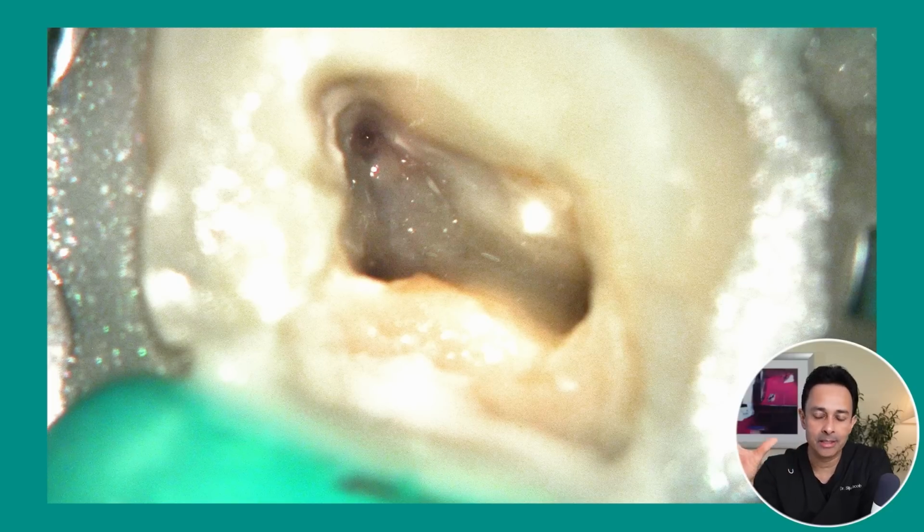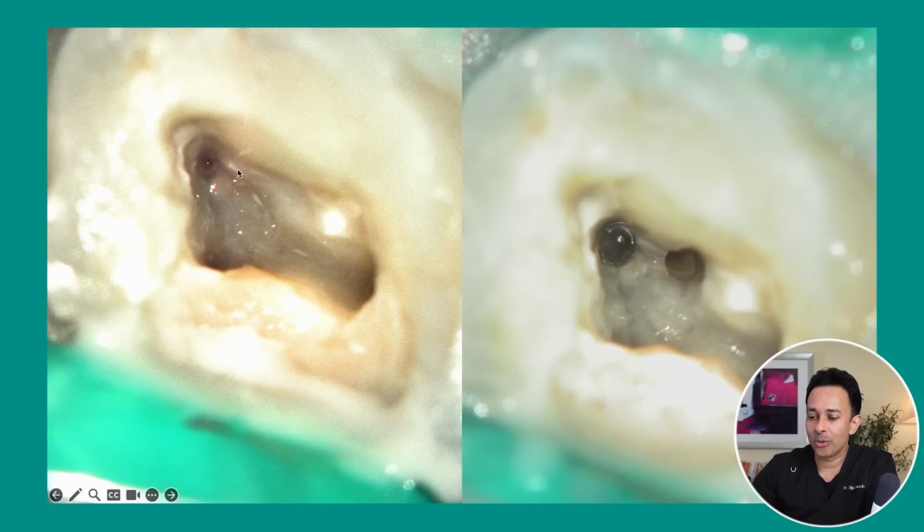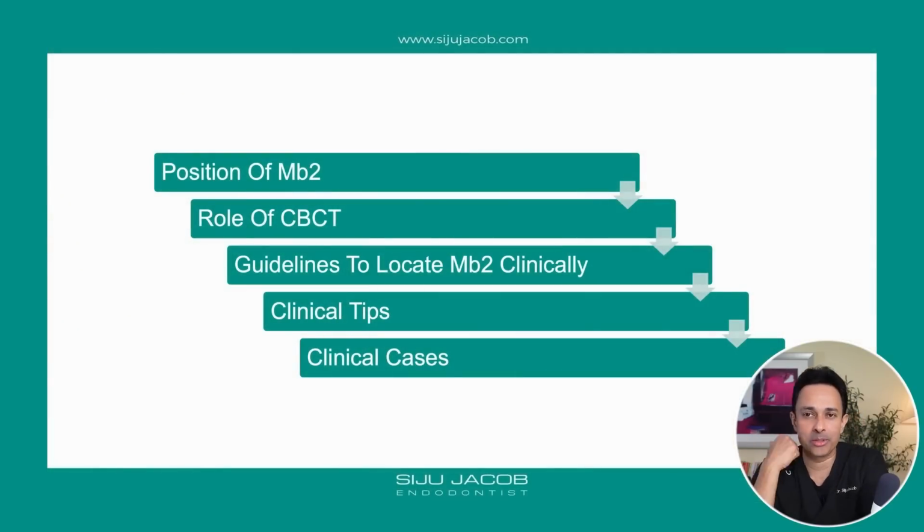It's usually hidden, and the goal is to first uncover this hidden canal. So you can see here, the goal is to bring it from the image on the left, which is what you see in routine clinical practice, to this picture on the right where you uncover the hidden MB2 canal. So this is what we go through in this particular video.